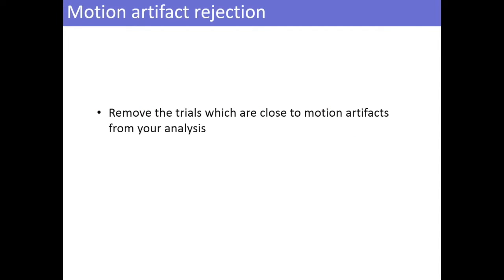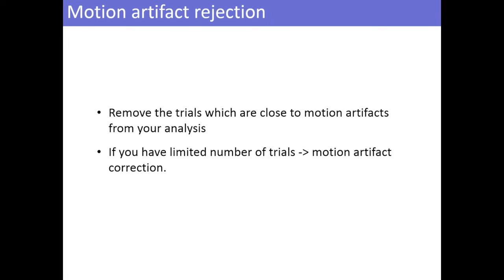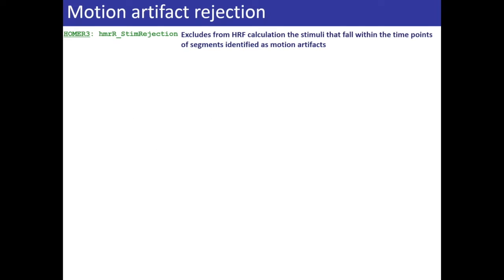So after detection, we can either remove the trials that are contaminated by motion artifacts, or if we have a limited number of trials, as we said before, we can proceed with a motion correction algorithm. We have a function in Homer 3 for stimulus rejection. It's hmrR_StimRejection, you see here in green. And it has a user input parameter tRange, which defines the time range within which, if there is a motion artifact, the stimulus will be rejected.